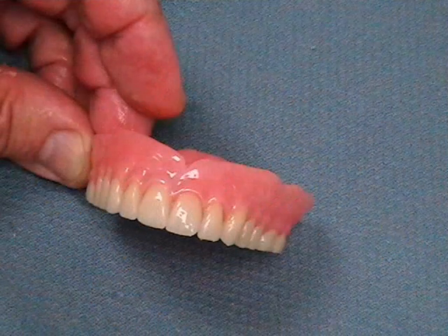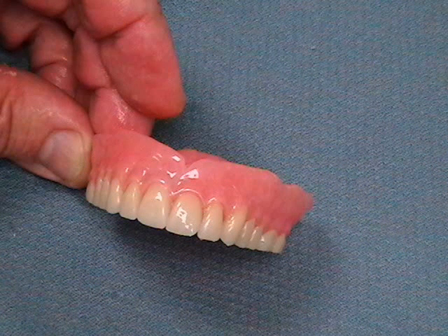The denture is now ready for surface disinfection and is sealed in a plastic bag. The denture is returned to the clinician for placement.